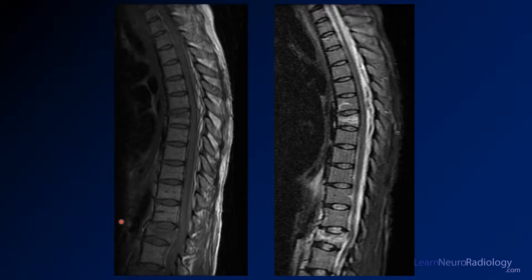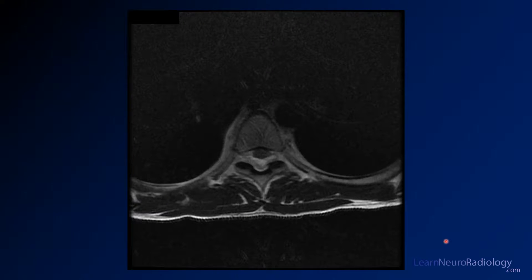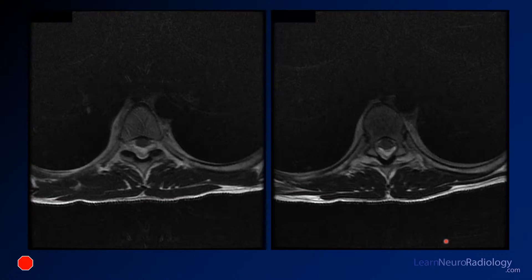It's a little bit challenging to tell what kind of images you're looking at. This is a T1 pre-contrast on the left and this is the T2 on the right. Here we have some axial images through the area of abnormality — this is a T1 weighted image — and a couple of additional axial T1 weighted images through a few adjacent levels.